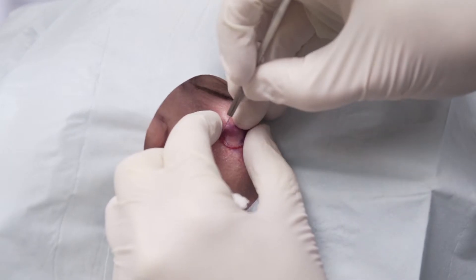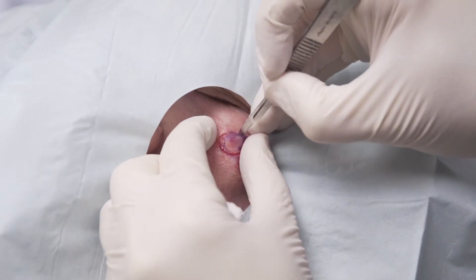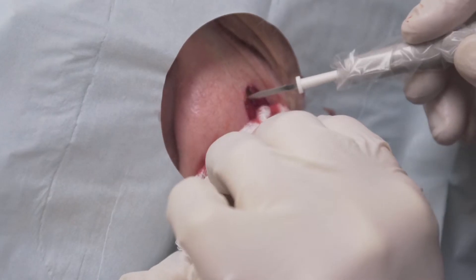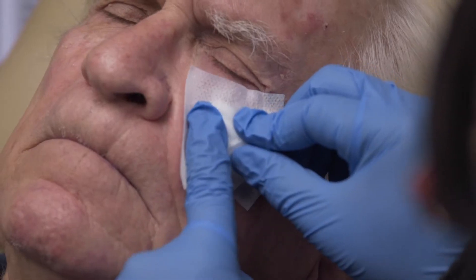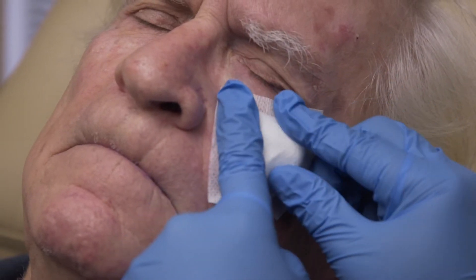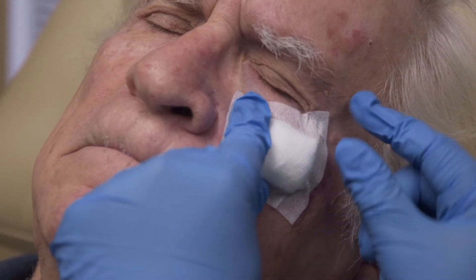The first step of the process involves removing the visible tumor with a very small margin of tissue around the edge. The wound is then cauterized as necessary to stop any minimal bleeding, and a sterile dressing is placed over the top. You may then be asked to go to the waiting room while the tissue is processed and other patients are treated.